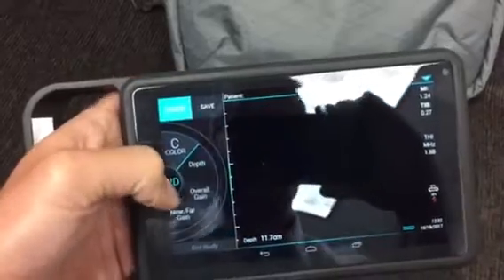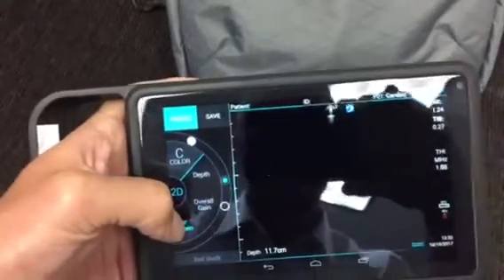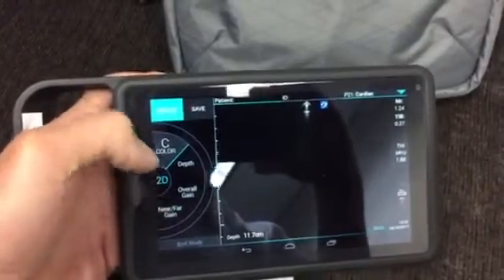To get out of depth control, we hit depth again. Overall gain is similarly straightforward — we can manipulate it, and then near gain and far gain are toggled just by tapping. So now we're controlling the far gain, and then back to 2D imaging.